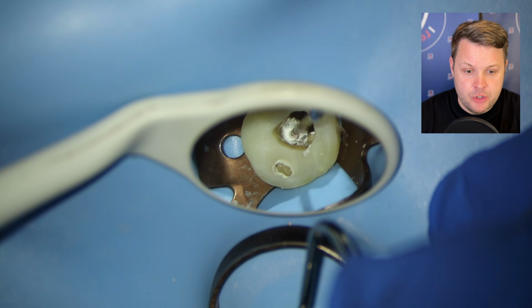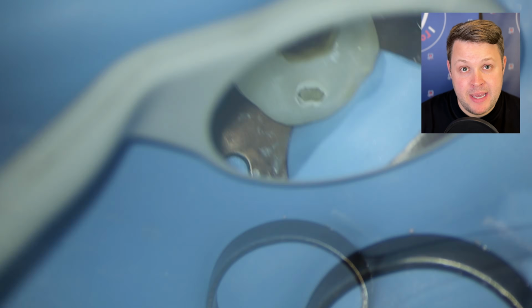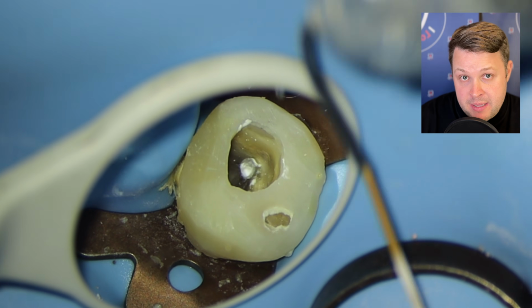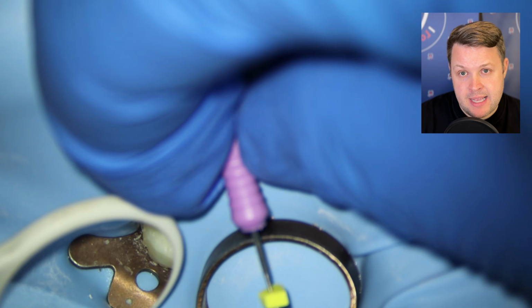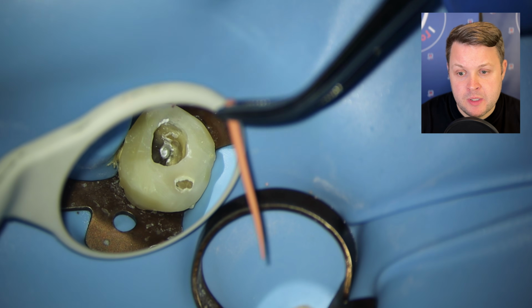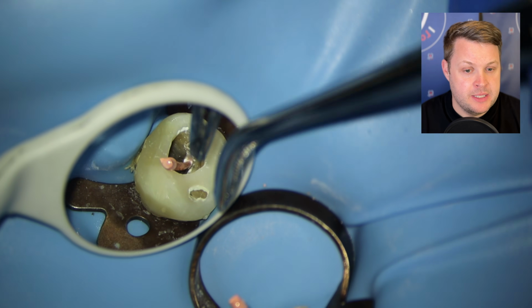However, in contrast, with other canals that are patent, you don't want to use that technique. I'm just going to use a more traditional single cone technique, where I just fill the coronal to mid-third with bioceramic. I'm then going to get a hand file and introduce it almost to length to carry the bioceramic to the full length of the canal, and then very, very gently push the cone to length and sear it off with a heated plugger.